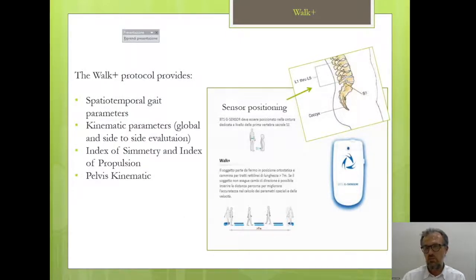The Walk Plus protocol gives us spatio-temporal gait parameters and kinematic parameters, for the global or side-to-side evaluation of the lower limb performance during the gait cycle.